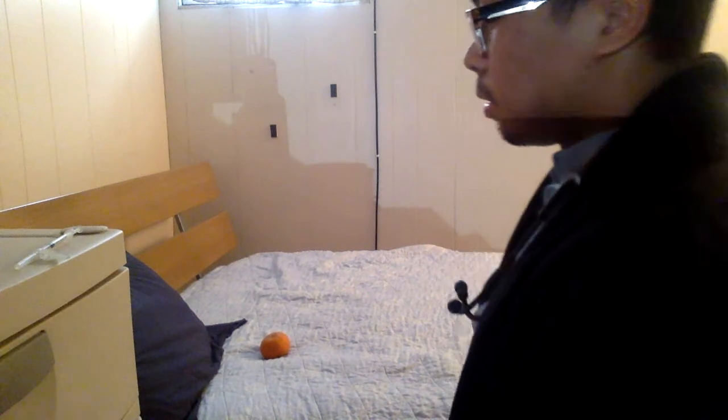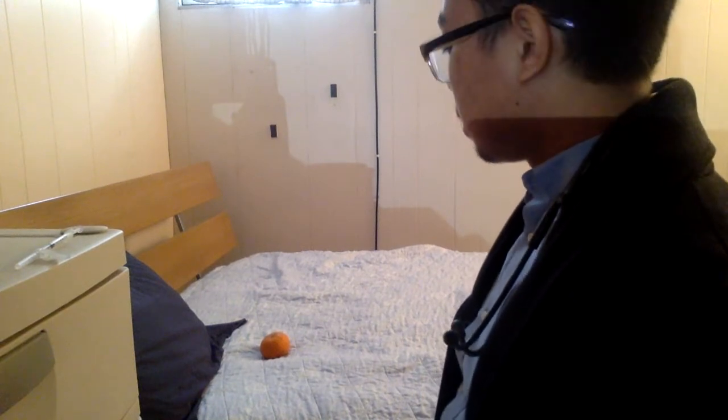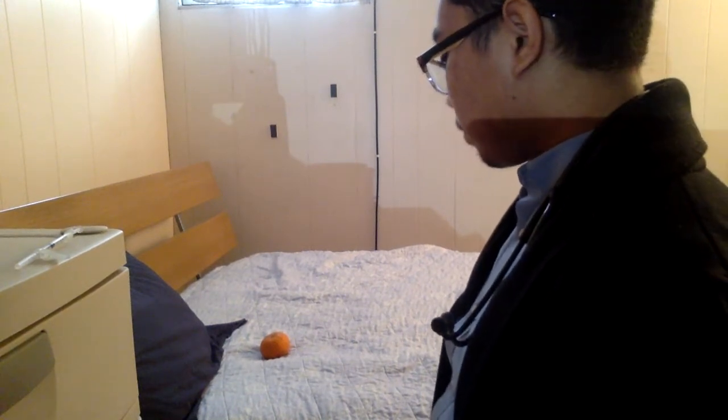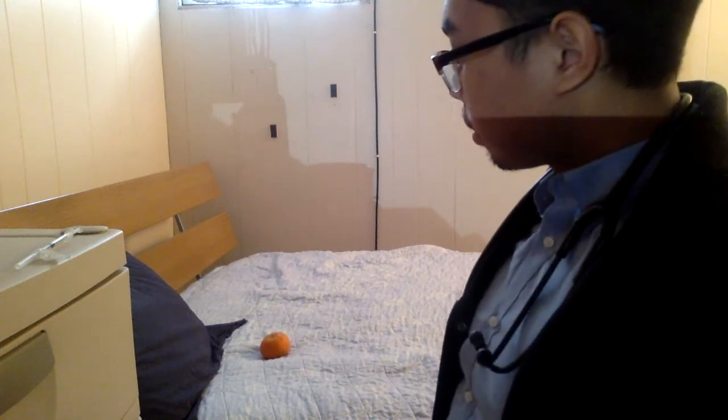Good morning, Mr. McDougall. My name is Nurse Kenneth. I will be here to help you today. I'm going to be administering your insulin injection. We're first going to start. Can you please verify your first and last name and your date of birth?